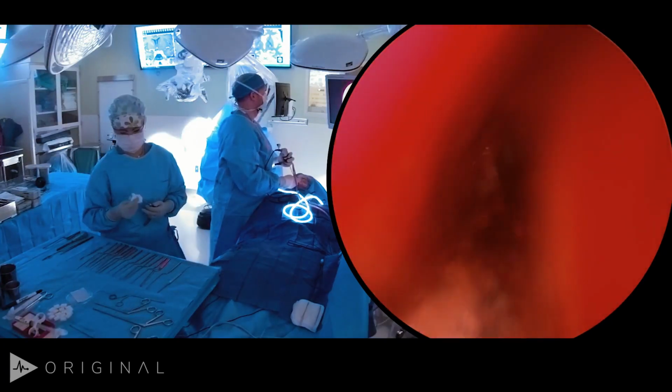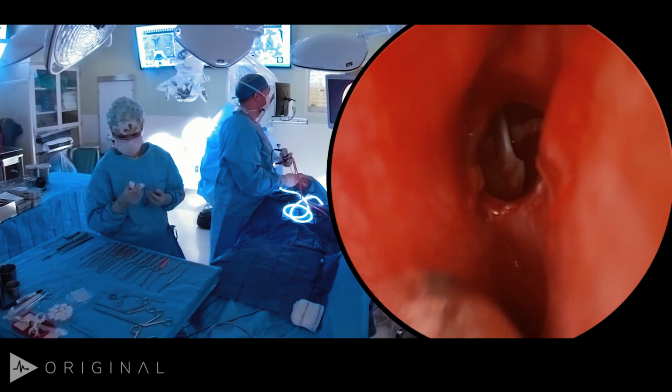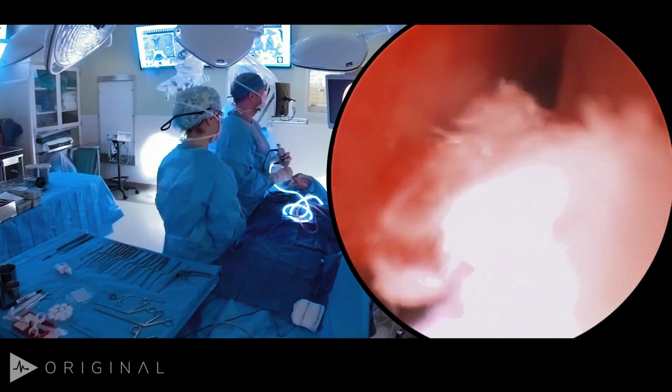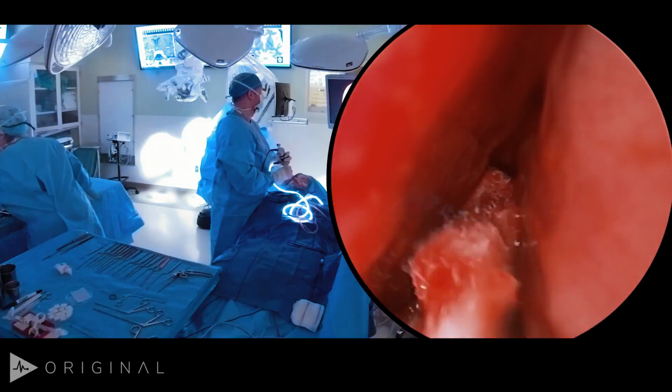Whenever possible, you want to avoid stripping some of that mucosa, otherwise it'll bleed. And we're able to kind of get a better look into that sphenoid sinus now. I'll take an afrin soaked pledget. If you run into any bleeding and you feel like you can't see well, it's worthwhile sometimes to just put a pledget in there and let it calm down.